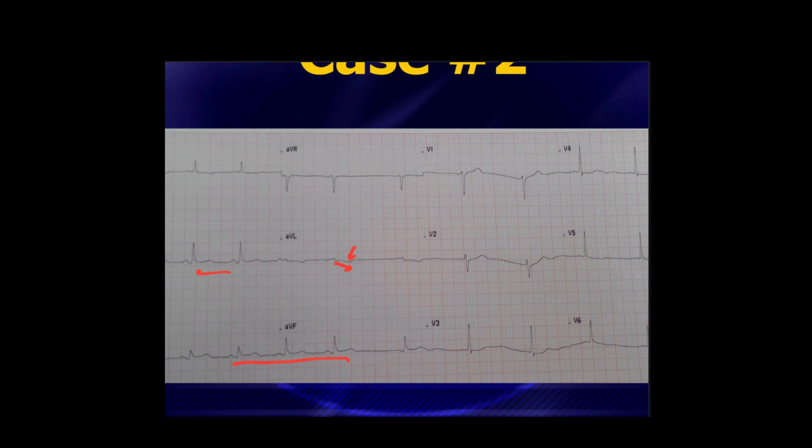This is not early repolarization. You should never diagnose early repolarization when there's a flipped T wave or ST segment depression in AVL. That rules out benign early repolarization. There's just a little hint of ST elevation in those leads, not a full millimeter, so your computer won't call it yet.